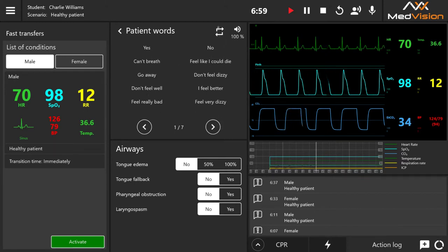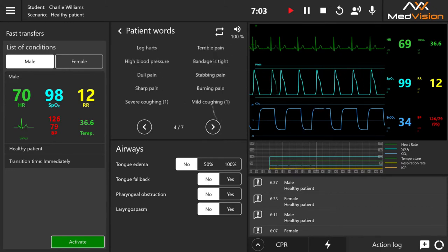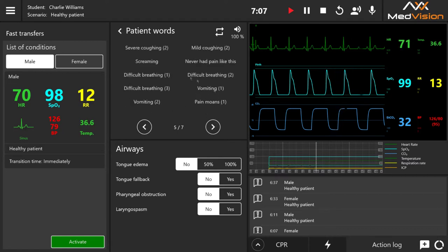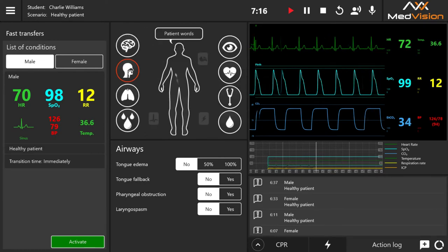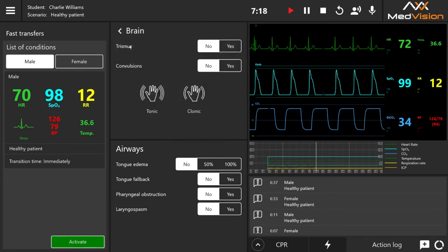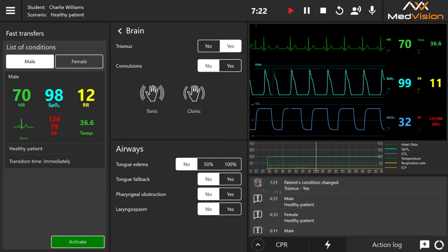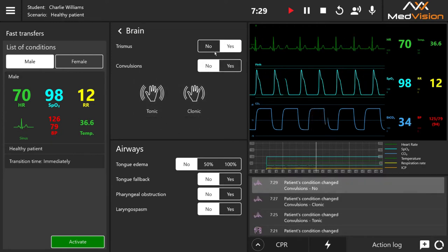Scrolling further, you can see sounds including mild coughing, severe coughing, difficult breathing, vomiting, and pain moans. Looking at the icons, the brain icon contains trismus — you can see the condition change in the action log — and convulsions, which can be tonic or clonic.